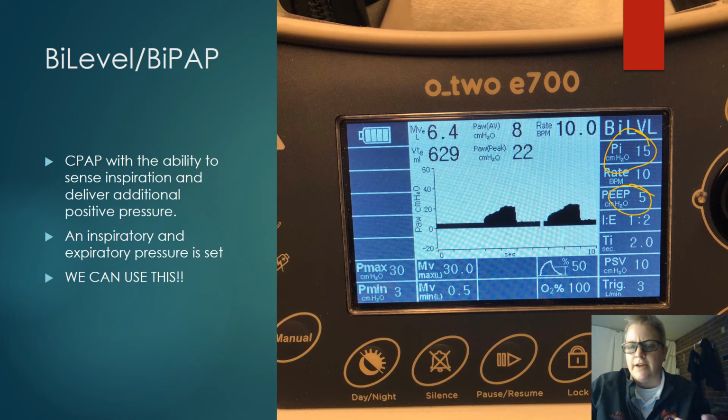It's similar to the SIMV with pressure support in that the rate remains constant, and the time of spontaneous breathing, that window that they can trigger, resets or changes if they trigger something. So if they trigger a breath themselves, then that window resets, so they are less likely to stack on this. So that's pretty cool. So try it.